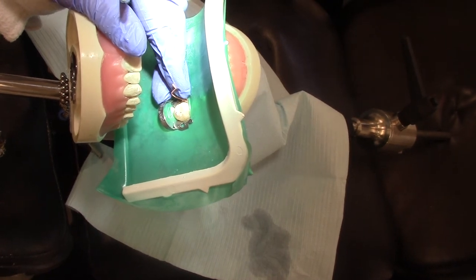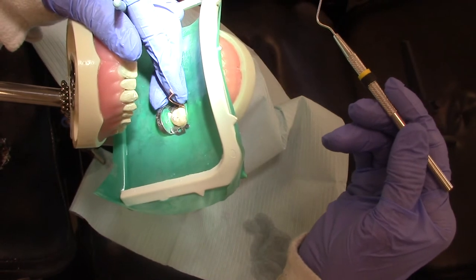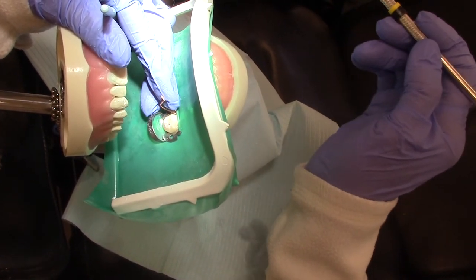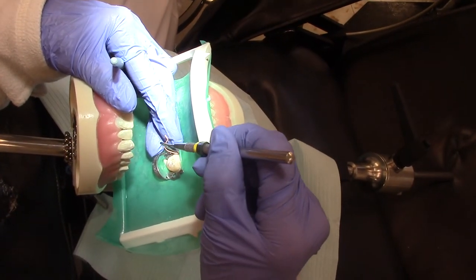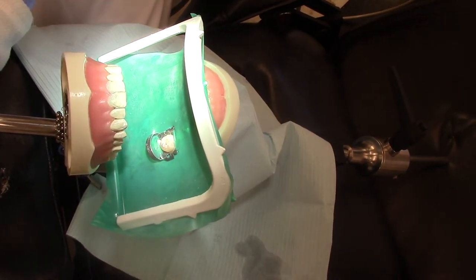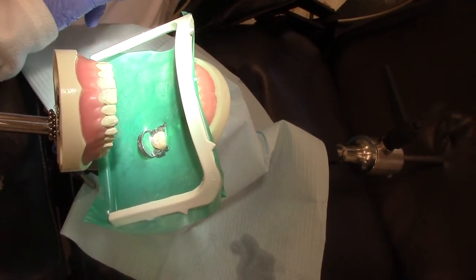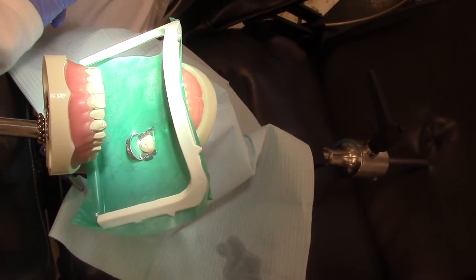Beth is going to light the torch and I'm going to light it. This would heat up my instrument — the instrument goes down inside the canal and it will burn off the top part of the gutta percha. Now we have all the canals filled.